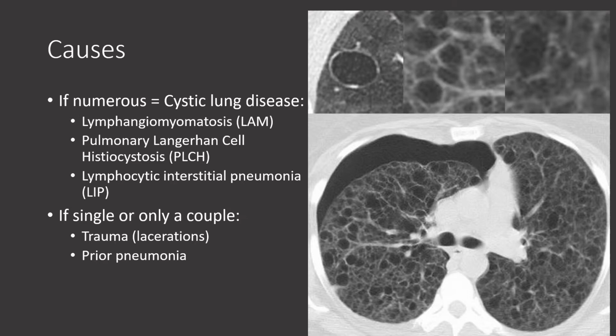A single small cyst or a couple of cysts are not normal, though they have a relatively low likelihood of being clinically relevant and are sometimes mentioned in the reports, though usually not expanded upon. These may be the result of prior infection or trauma.